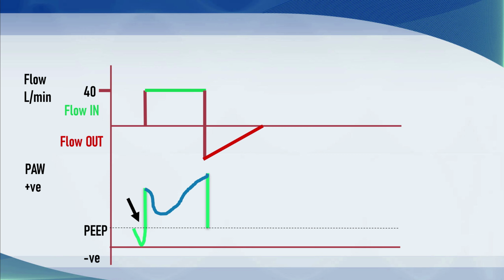And that's the negative pressure you're seeing within the airway, but it does not show you the whole picture because the transpulmonary pressure, that's the negative pressure that's within the pleura with respect to the airways, may be really, really negative.